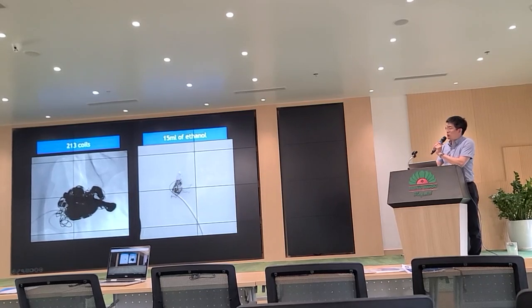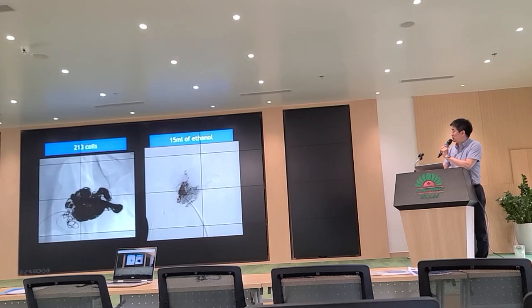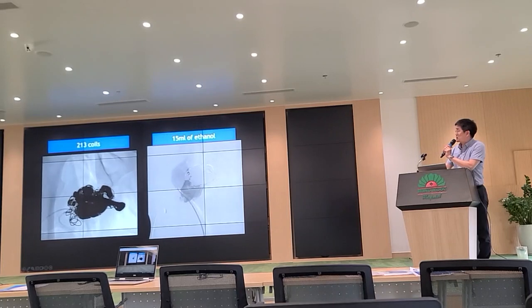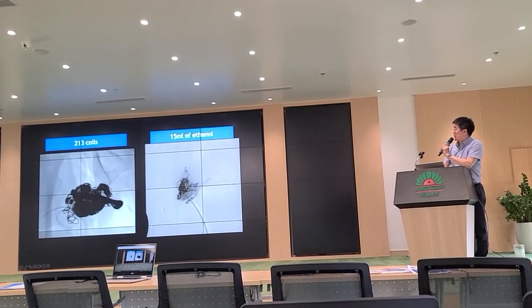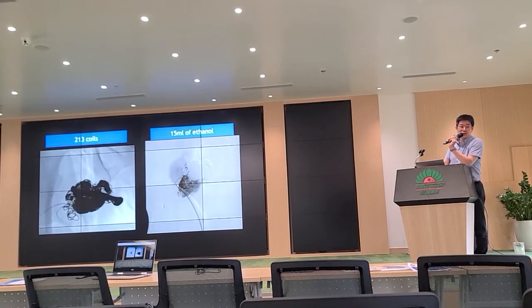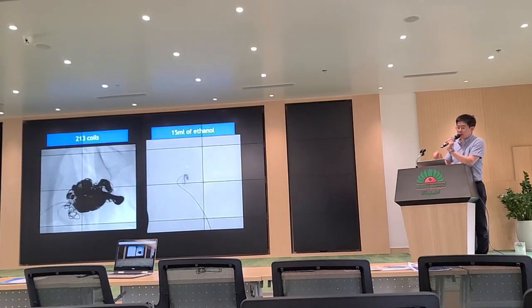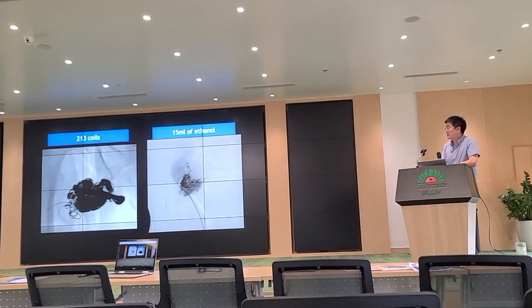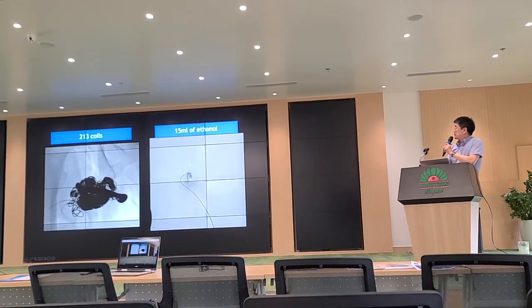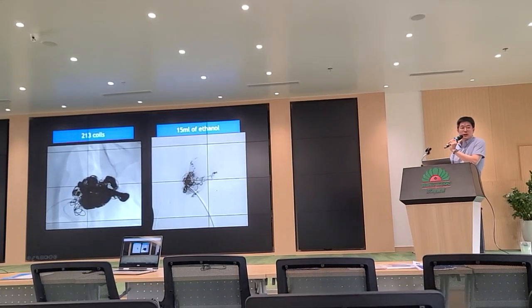After we put in many coils, another catheter was inserted at the beginning of the procedure. We did angiography. You can see other feeding arteries and a draining vein. At that time, we injected ethanol 15 cc three times, divided by 5. Even though you can see very high flow like this, when you inject the pure ethanol, we can destroy some part of the feeding artery.